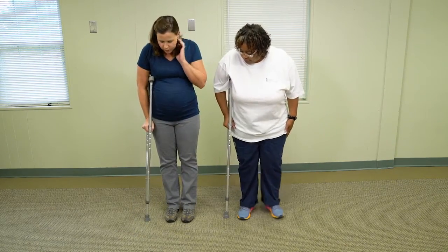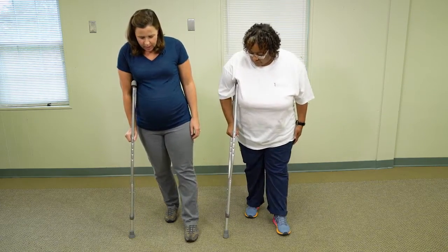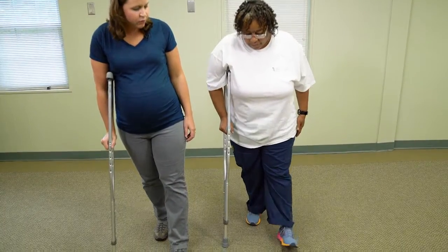So what you would do is still put the crutch out in front of you, take a step with that left leg, push through the arm, and then take a step with the right. I gotta take a bigger step. Only if you're comfortable with it.